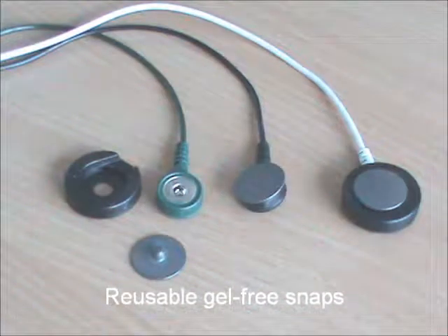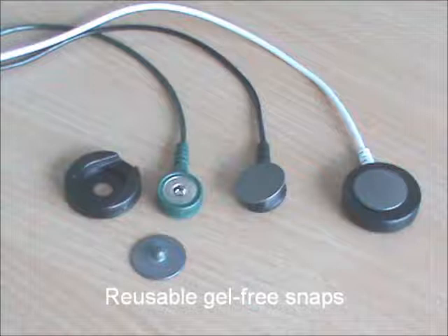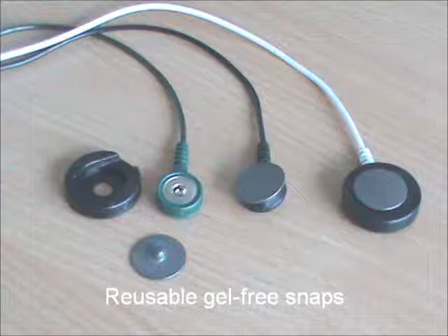These also just snap onto the heads of the sensor cables. When you connect them to the skin, it's important they don't touch each other. The black plastic ring shown in this image is a means of guaranteeing this, although you don't actually need to use it. It fits between the snap and the cable head.